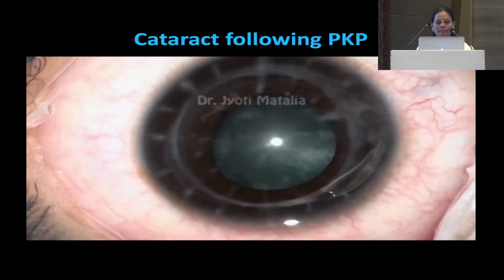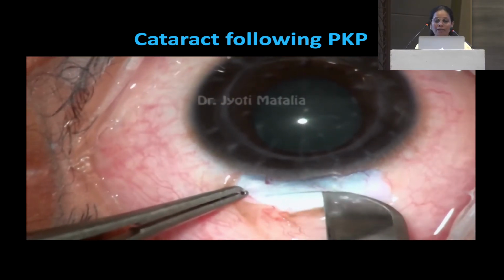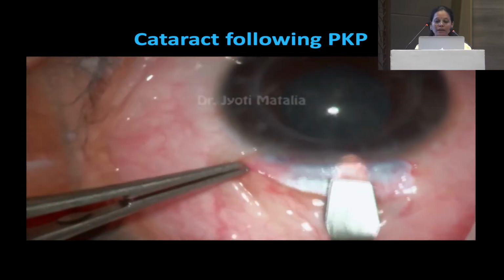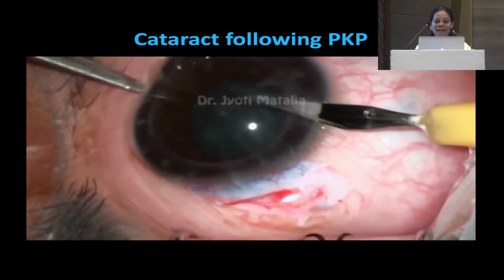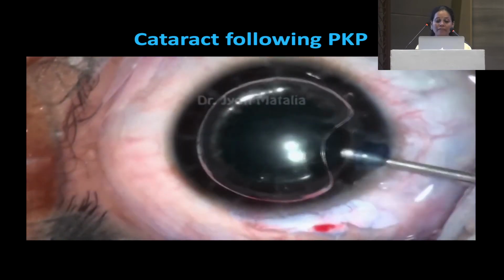The next case. This is another case where the patient has undergone a penetrating keratoplasty, there's a graft intact and you are planning to go ahead with the cataract surgery. So prefer to do a scleral tunnel here because you do not want to enter anywhere close to your graft host junction. So we have done the tunnel as you can see, and side ports again, see that your entry does not go close to the graft host junction, and that is very, very important.